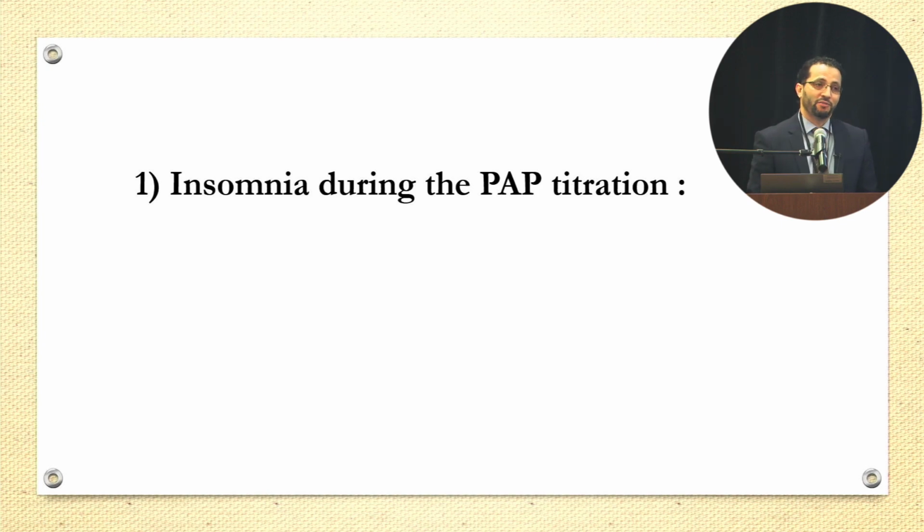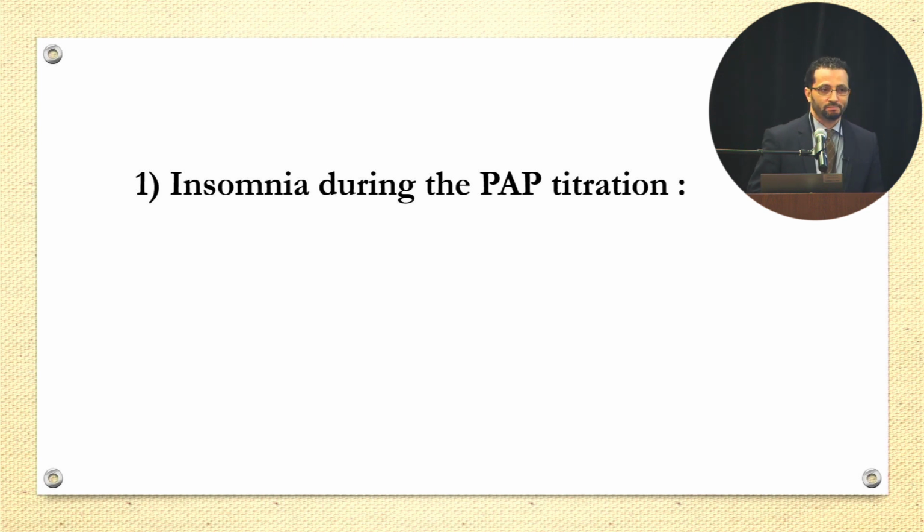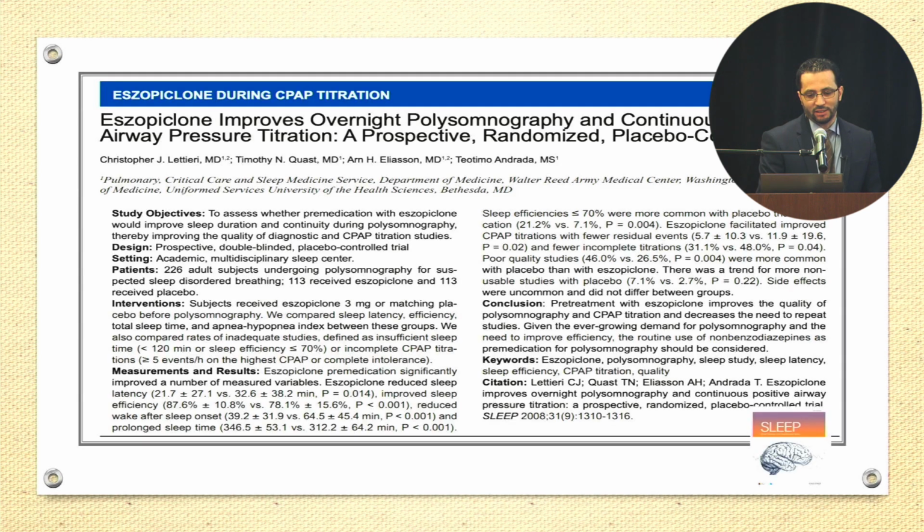So the first challenge we may face is that the patient won't sleep. Insomnia on day 1: this is either first night effect, or the patient is nervous or having other issues, but you put on your CPAP mask and your patient won't sleep. What do we do? Try to calm him down, try to reassure him, but should we use hypnotics?